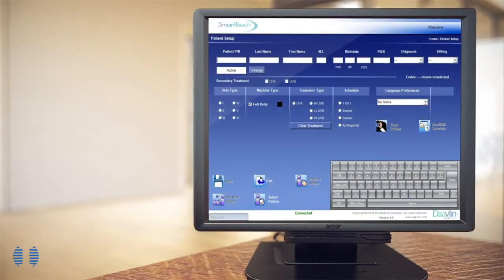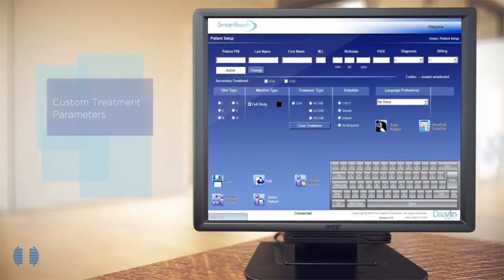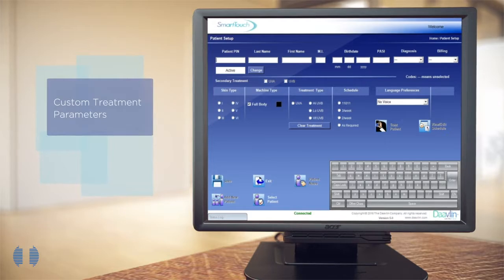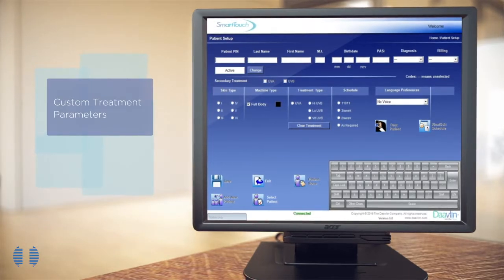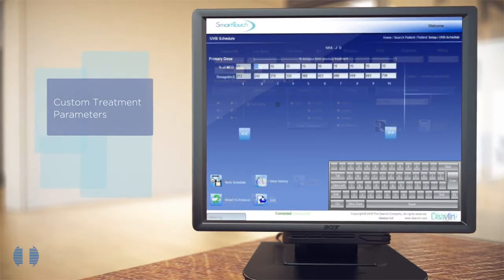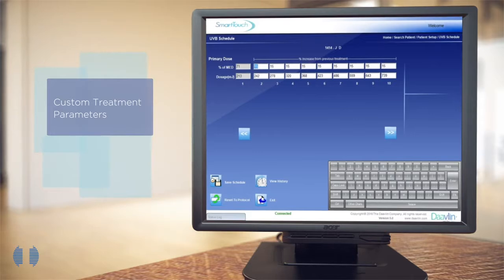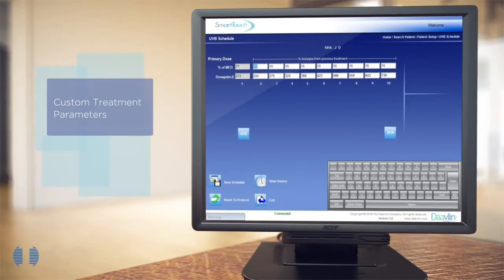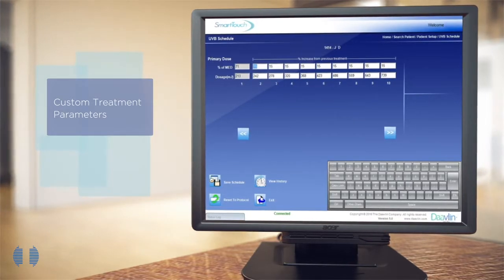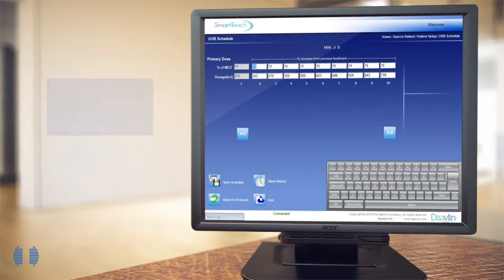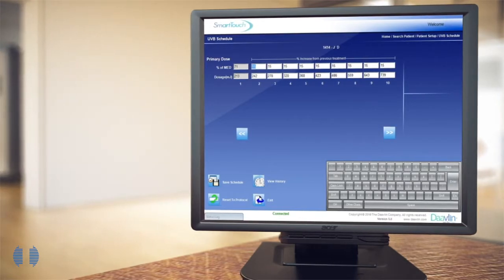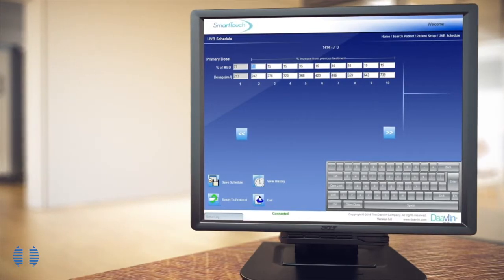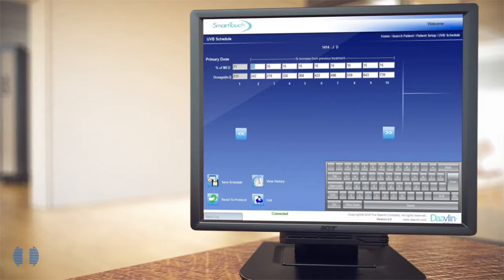Smart Touch technology allows you to set and lock in custom treatment parameters for each patient. The technology monitors things like treatment intervals and dosage increases based on the patient's individual treatment plan. With such sophisticated oversight, it's next to impossible to mistakenly administer the wrong treatment.